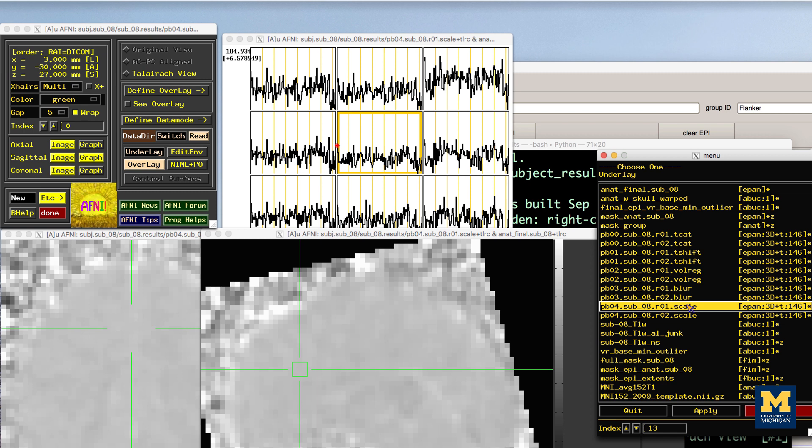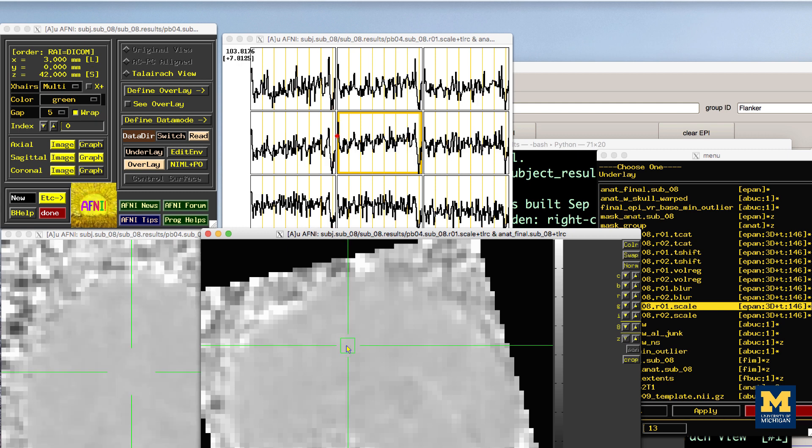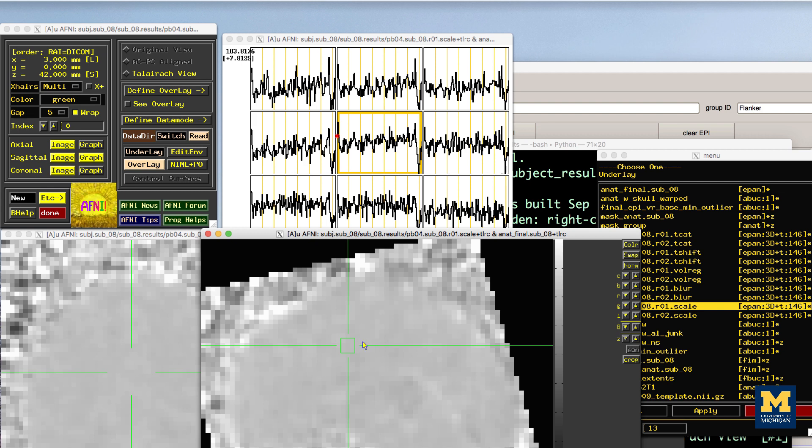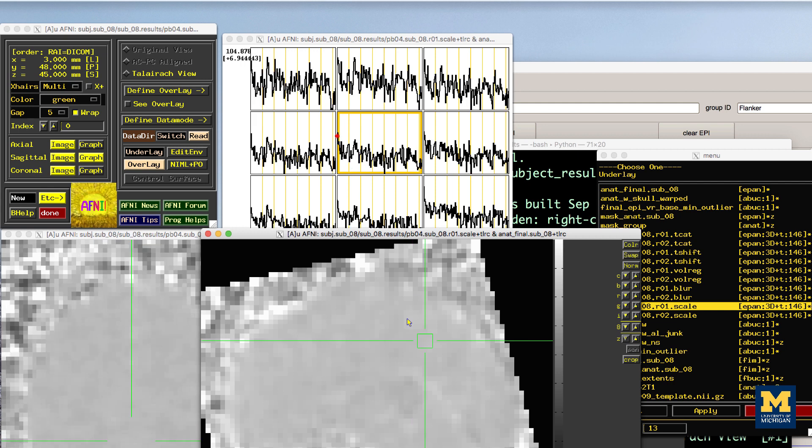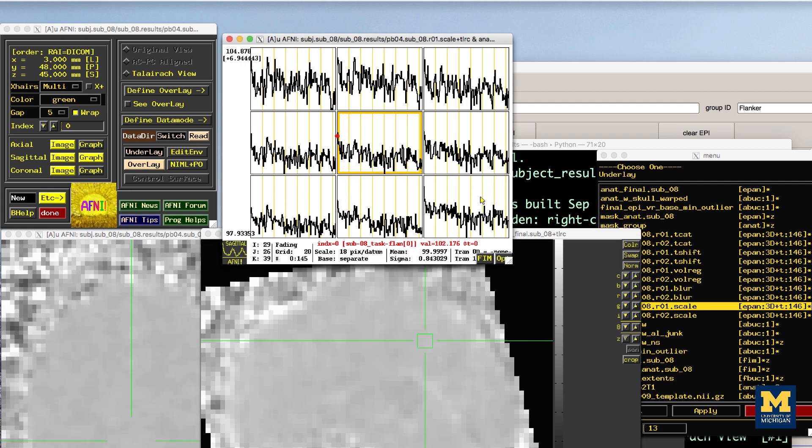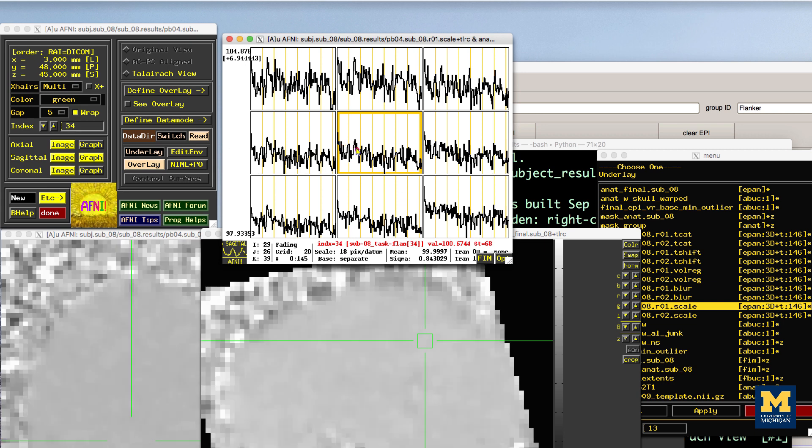Due to the gray scale of the images being more uniform in the brain voxels as compared to greater variability in the signal outside of the brain, these images will look less defined than the previous images. Nevertheless, you should still be able to see the outline of the brain, and the time series values of the brain voxels should all be close to 100.